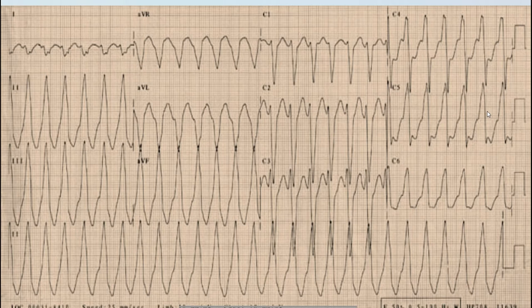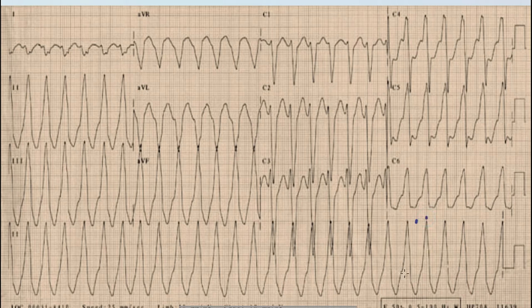Beginning with the discussion — as you can see, the very first and prominent thing on this ECG is tachycardia. The heart rate is around 150 to 300. Also, the QRS complex is wide — it is more than three small squares — so this is a broad complex tachycardia.